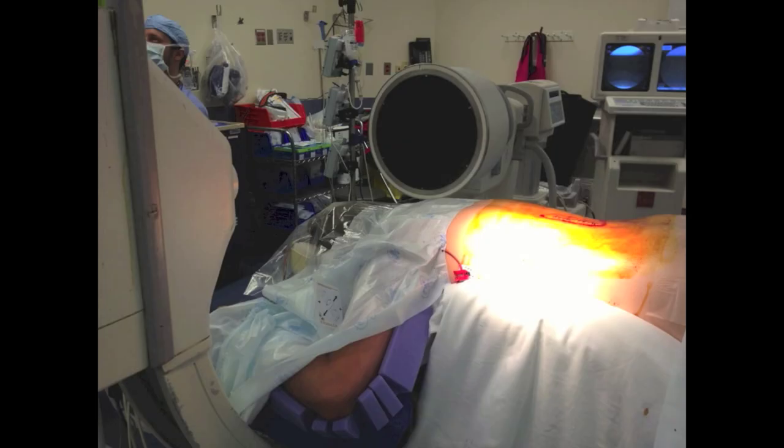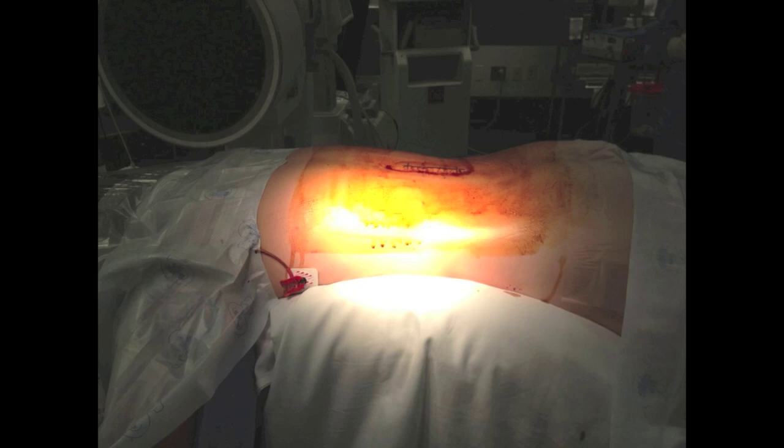The patient is placed in a prone position on a Wilson frame. The spine is exposed through a midline incision and subperiosteal muscle dissection. A bilateral L1-L2 laminectomy is performed with preservation of the facet joints.